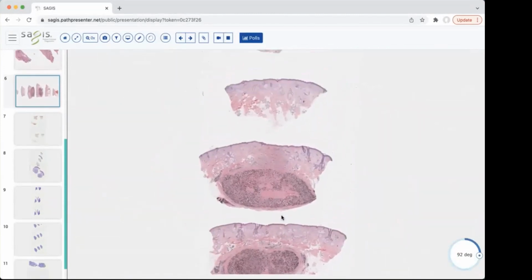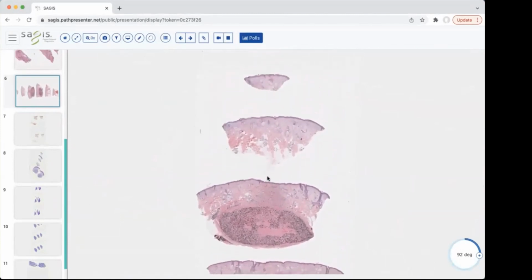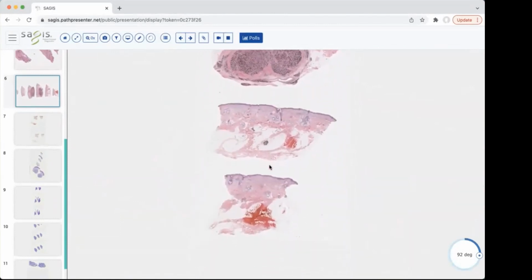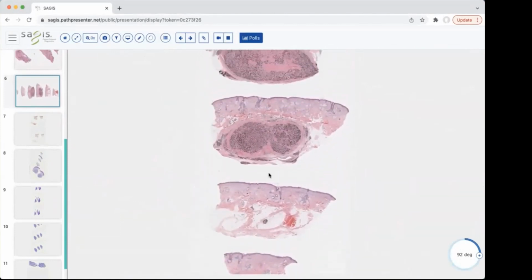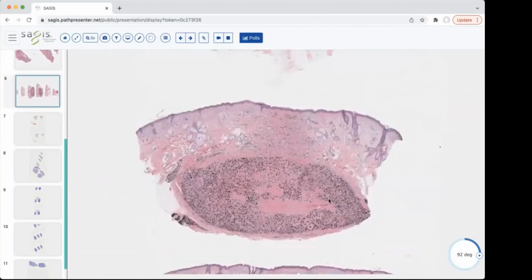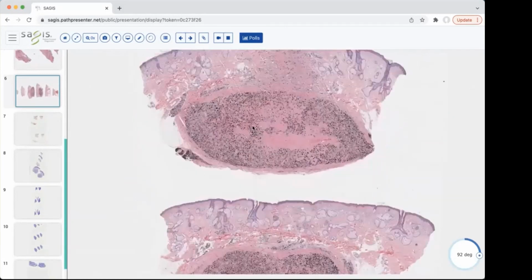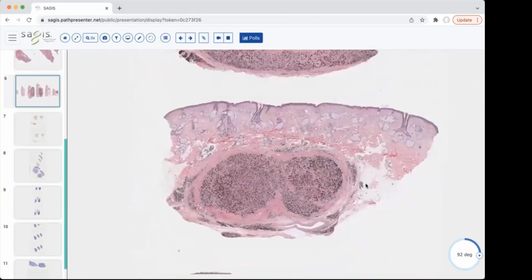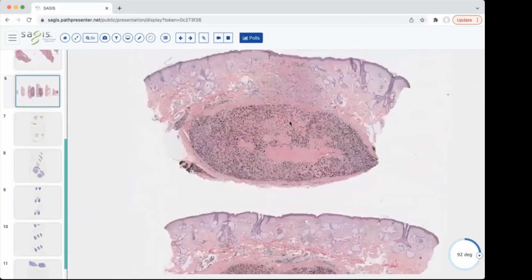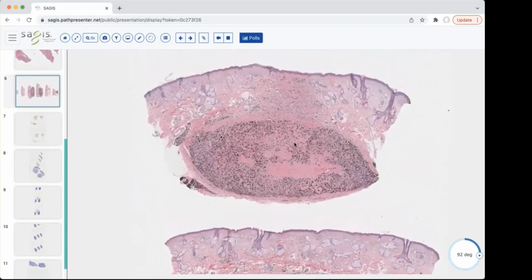Okay, I'll just pan through this next case. This was also an excision specimen. I think this is the most representative piece, so I'll let you focus in on that and let the computer catch up. There are many hair follicles here, and you can tell that there's a lot of subcutis. This may be on the forehead or near the scalp somewhere.